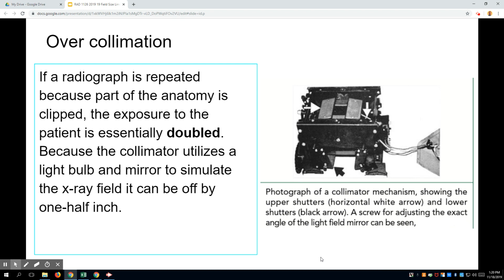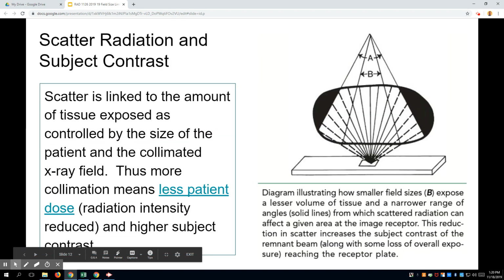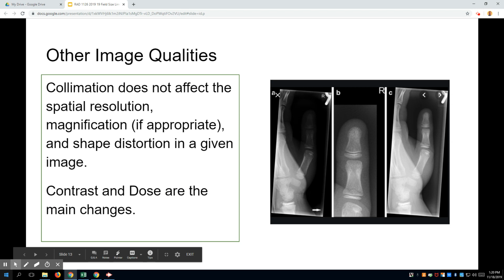There's an image, I think it's coming up over here. I'll go back again. But there was a time where you had to put multiple views on one cassette. We'll come back to this in a second. And when you did that, you could easily make a mistake and have one part overlapping on the other. And this took a lot more skill. So it should not be nearly as hard to get any one of these 3 views on one cassette. And that's the rule now.